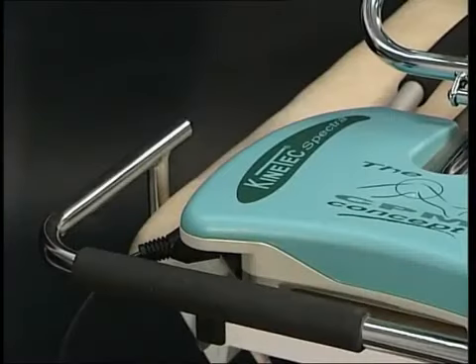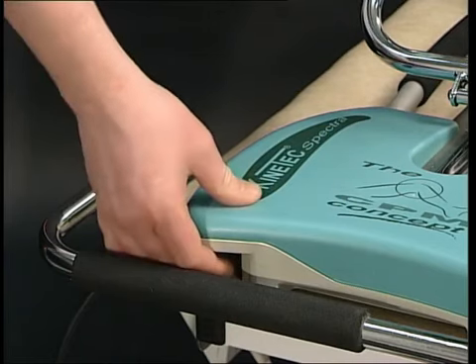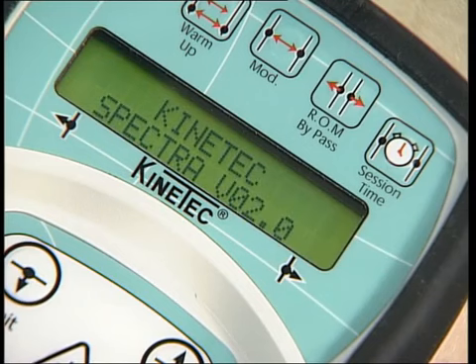Plug the machine into a standard earthed mains supply. When the machine is turned on, the screen lights up and the machine is ready for use.